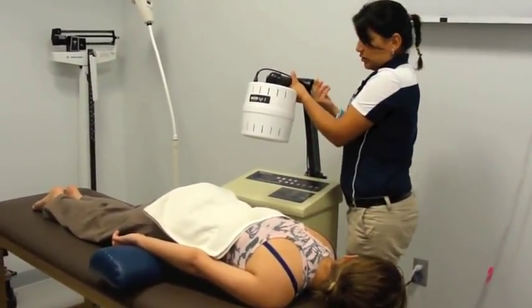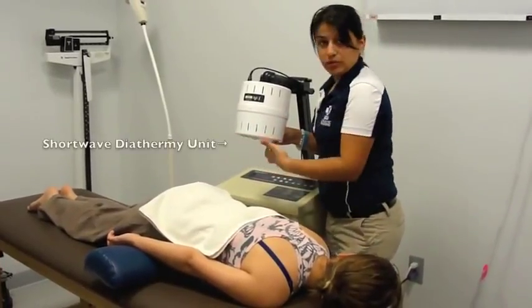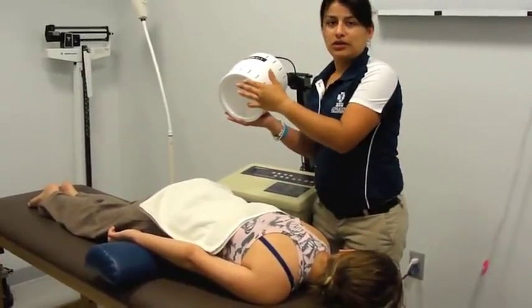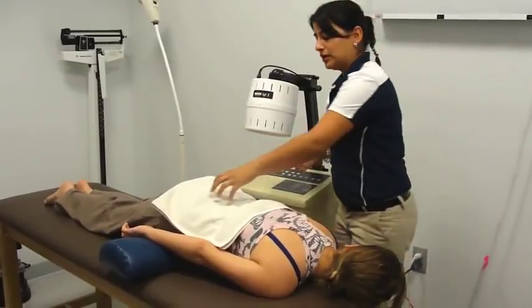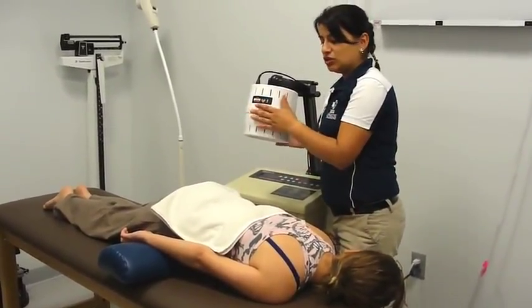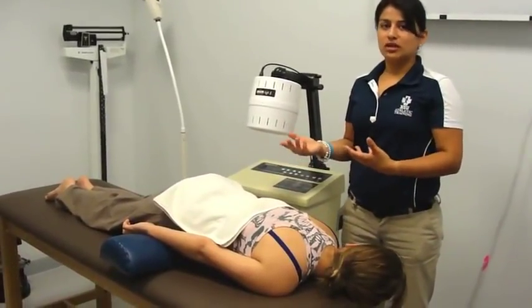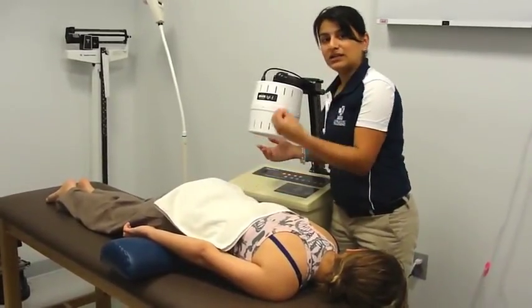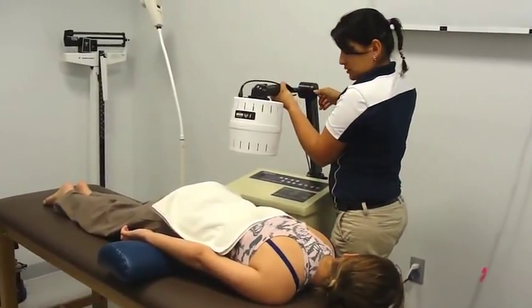This is the most important part. The area that is going to be treated is only in the drum. What you can see here is what is going to cover the area. This is a good modality for deep heating, and it's especially used in the low back because it's a bigger area. You can do it with ultrasound, but it's not going to have the same effect, because this is going to treat a bigger area and deeper. So now we're going to set it up.